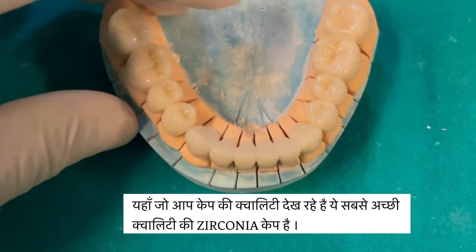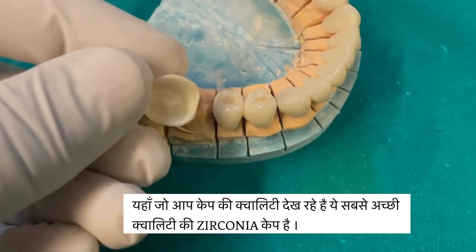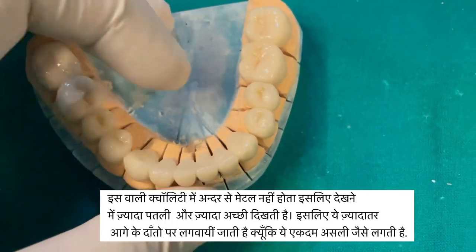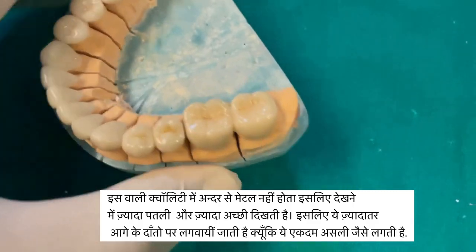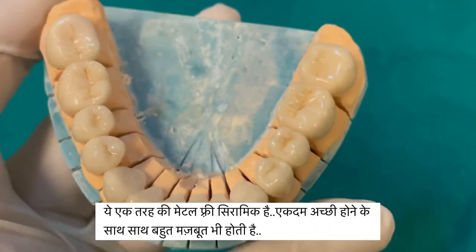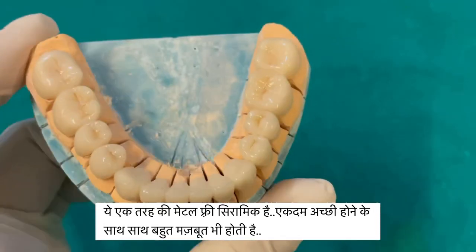Dental crowns also come in different types. Crowns are given to protect teeth which are getting damaged from excessive occlusal forces. Zirconia is a special type of crown which doesn't contain metal as an inner layer. In other words, it's a metal-free ceramic crown, which is widely used for front teeth as they appear more natural, thinner, and stronger at the same time.